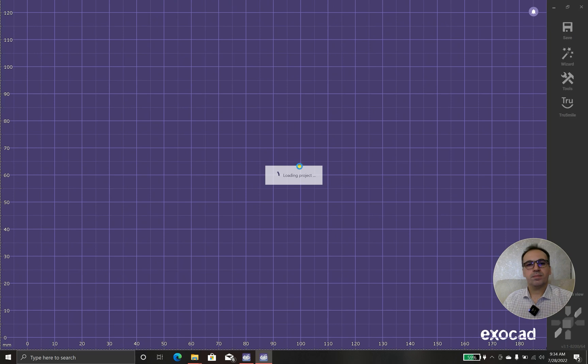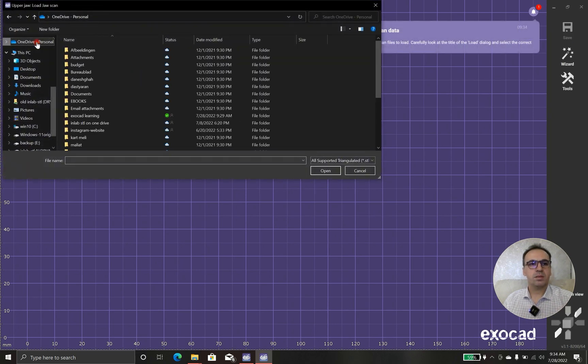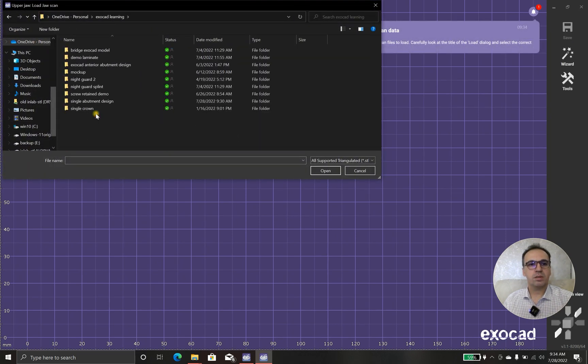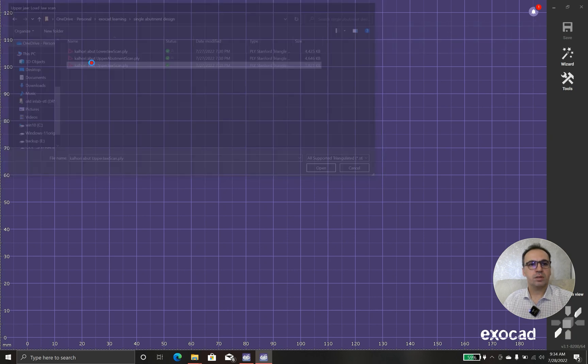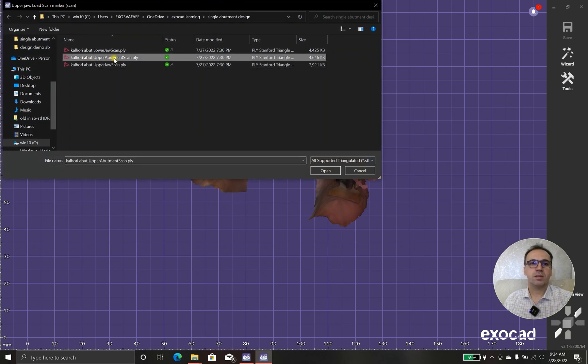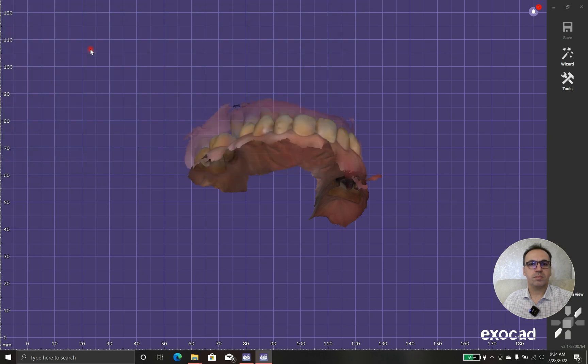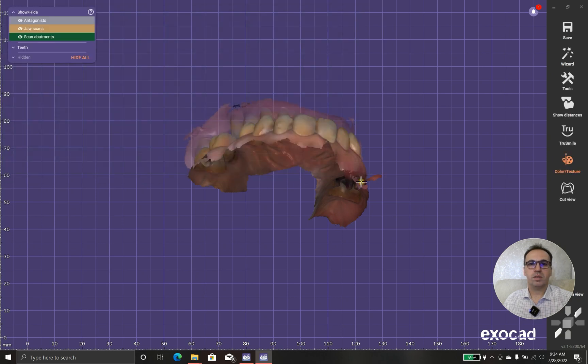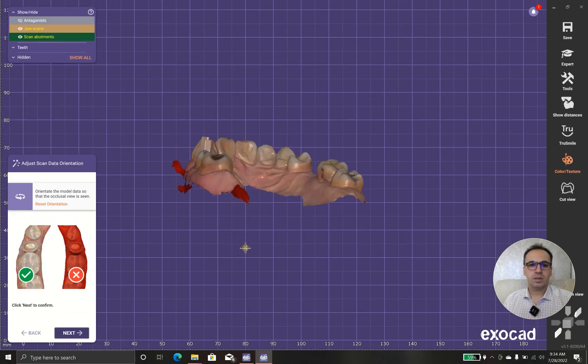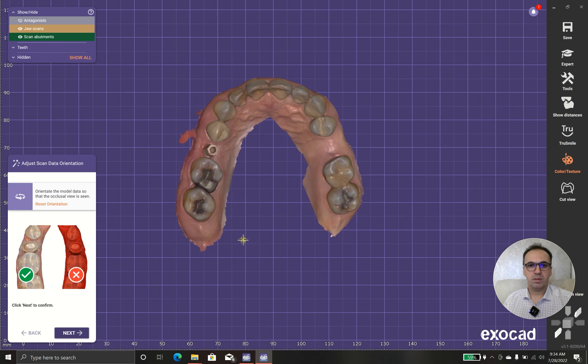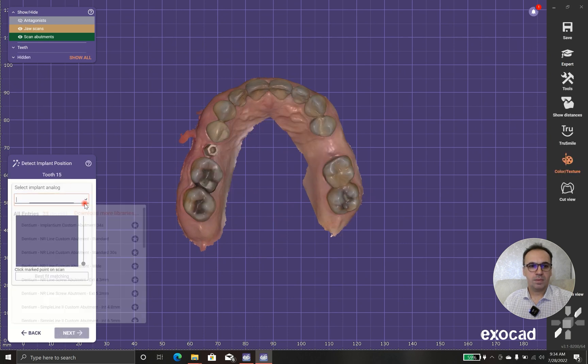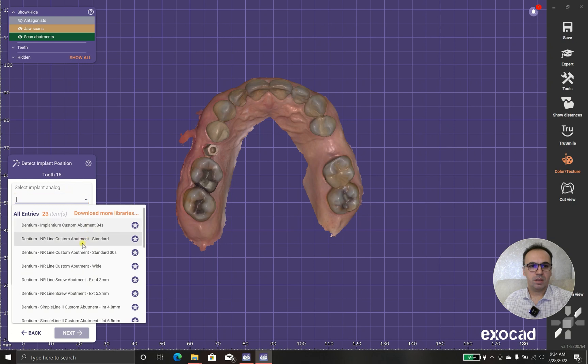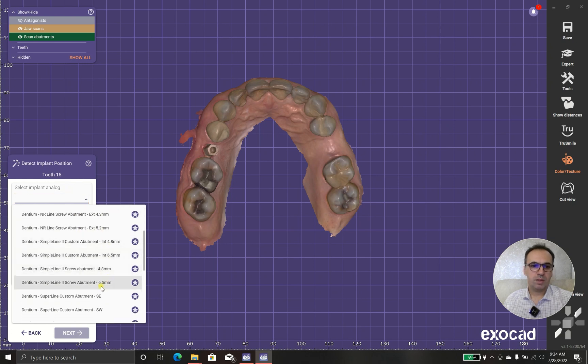So we should go here single abutment design first. Aperture, okay, aperture, scan marker. Okay, awesome. First I should put it in proper arch position.